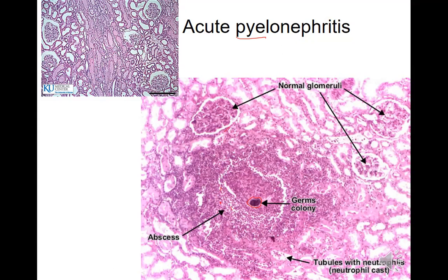So it started out as an infection in the urethra from the skin, or also the anal canal, which has E. coli, right? It's completely normal in the anus of the colon, but not normal in the urethra. It's going to cause an infection and an immune response. So this is basically a what? A UTI, a urinary tract infection that can go from the urethra all the way to the nephrons, the parenchyma of the kidney. So a lot of this is PMNs, a lot of neutrophils throughout this tubular area, right?